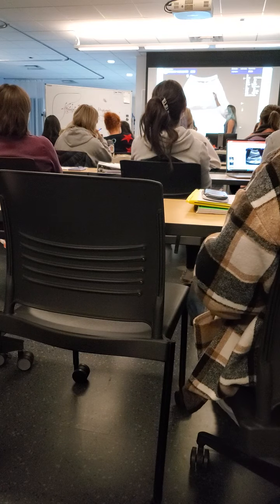Okay, so here we have a gallbladder wall. We've got some oblique views here. So here's the neck of our gallbladder coming back into our fundus. We're going to measure this anterior wall. Now you can see we've got an okay wall here, but with just how refractive some of this gets, it would be hard to say where exactly that wall is. So we're going to do an AP measurement, 90 degrees to the wall, not your screen, but actually to the wall, and get our measurement.